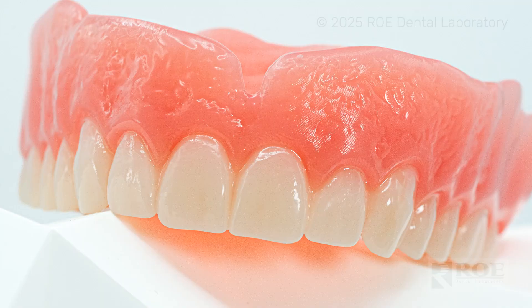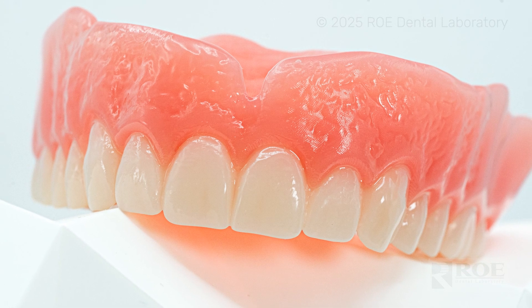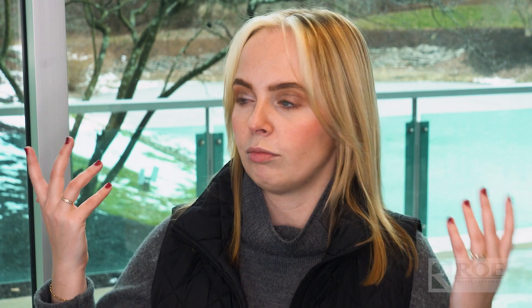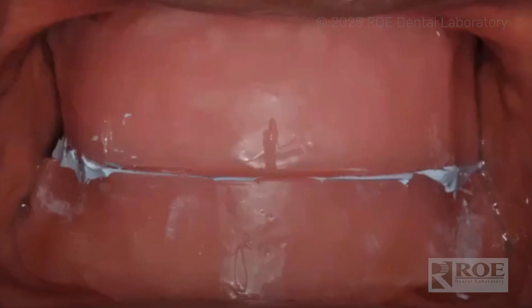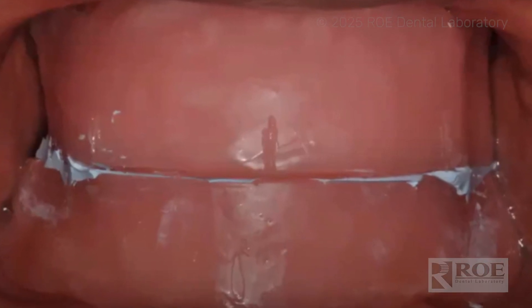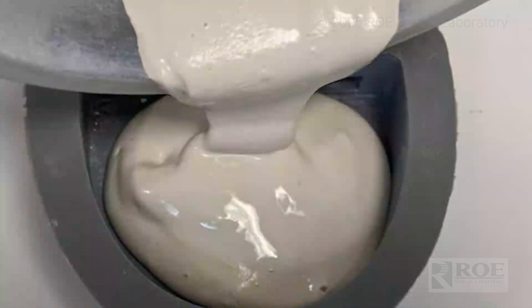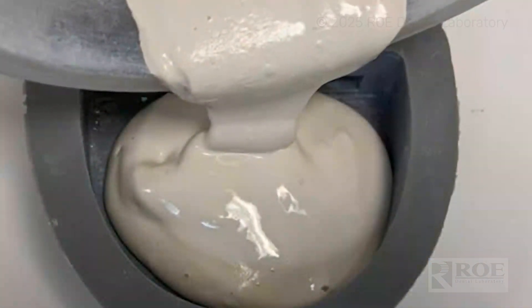Once we've received that bite block and information from you, we then digitize those records and begin designing and printing your patient's final impact denture. Now, I know what you're thinking — where's the wax try-in? With our digital denture process, we actually skip the wax try-in. The great news is these are taking less visits to fabricate versus a conventional denture record method, meaning if you like the denture next visit, you can take it home.